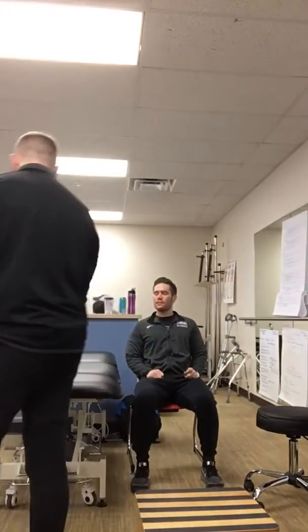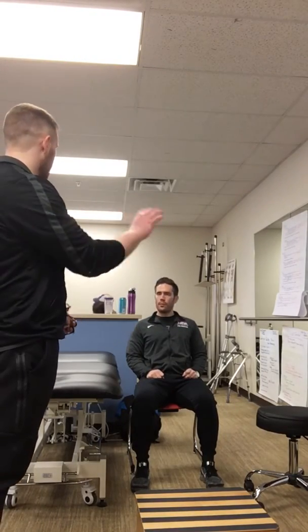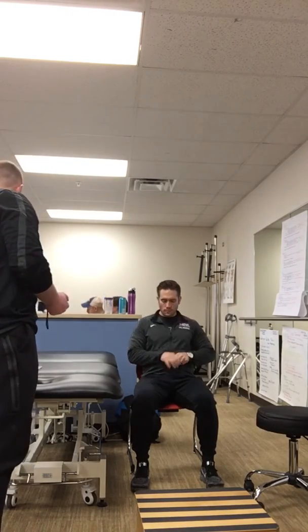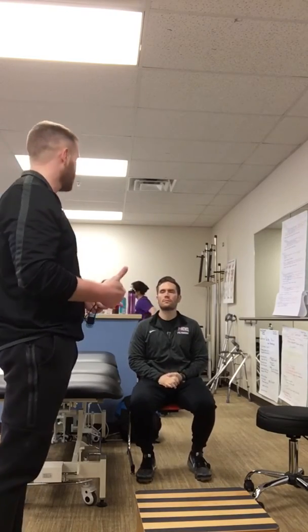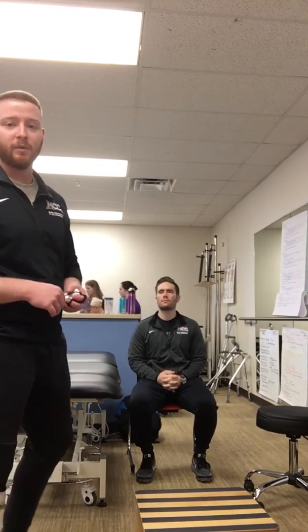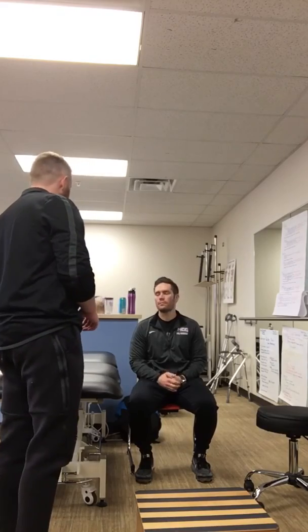Okay. So again, we went over the lung auscultation, the different areas, making sure we had the stethoscope on correctly. We went over the respiratory rate, nail bed assessment, and pulse oximetry before, during, and after activity. I'm also going over red flags that we want to look for. Do you have any questions, Chris, about anything we did? Nope. Awesome, thank you very much.